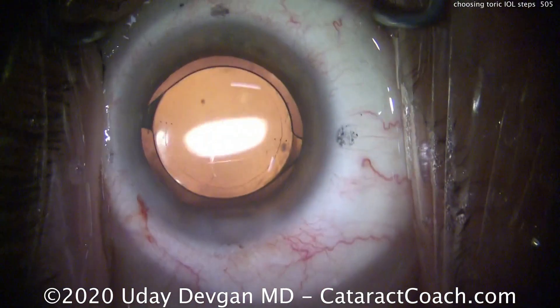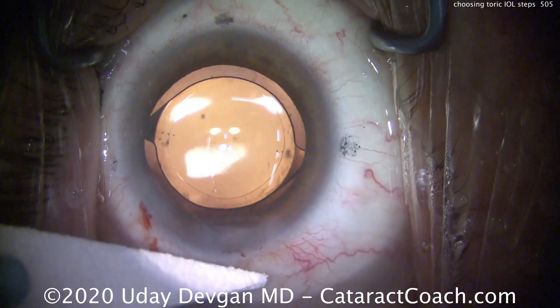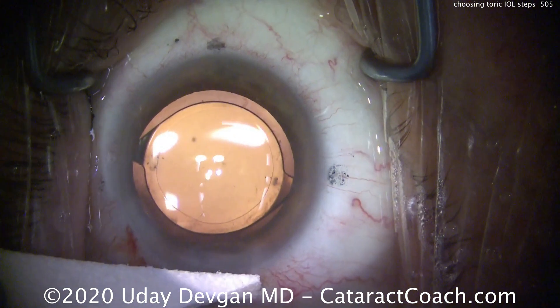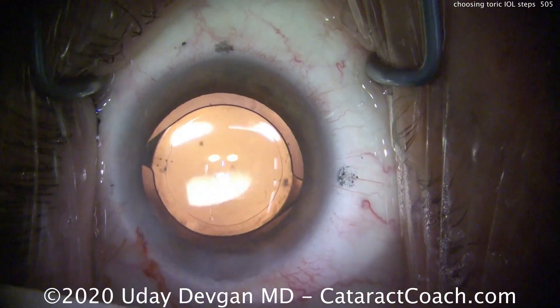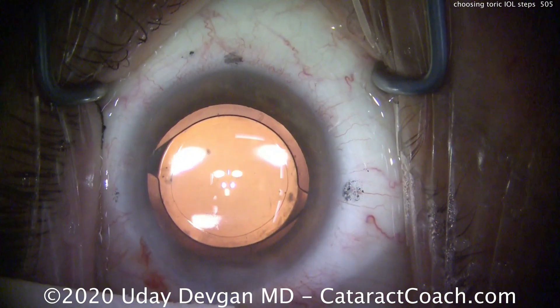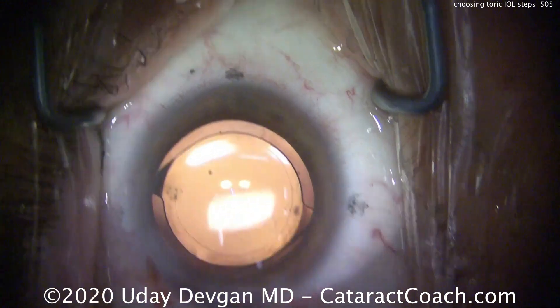At the end of the case, you can see a nice rhexis overlap, good position of the lens, and a nice angle of rotation at the correct meridian.